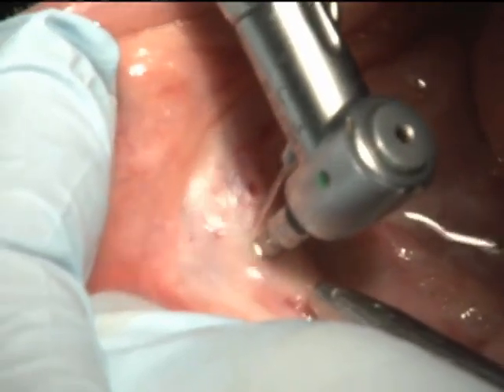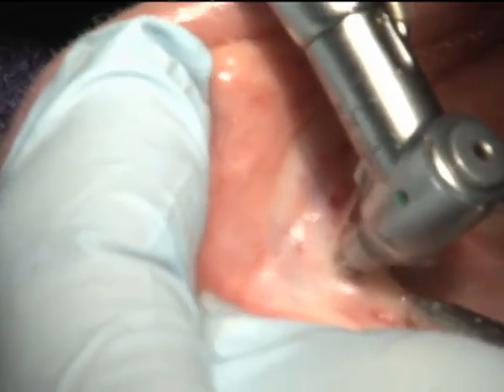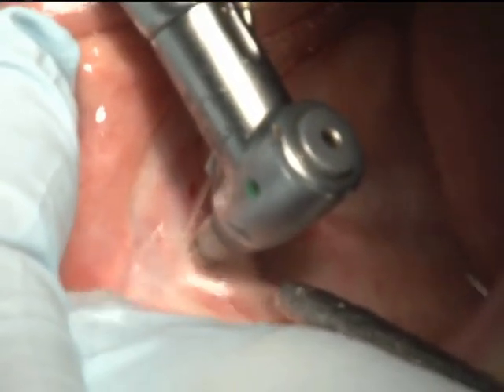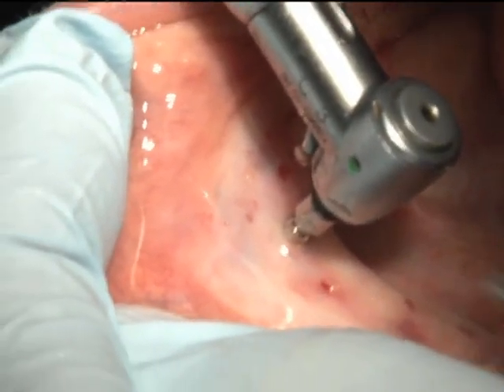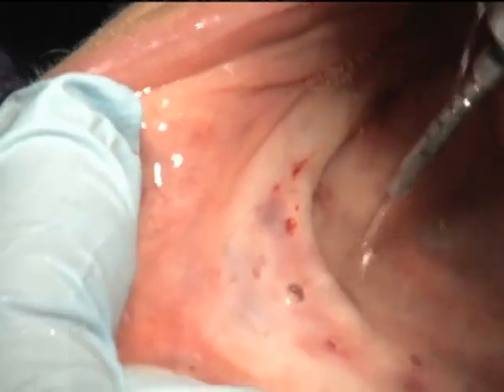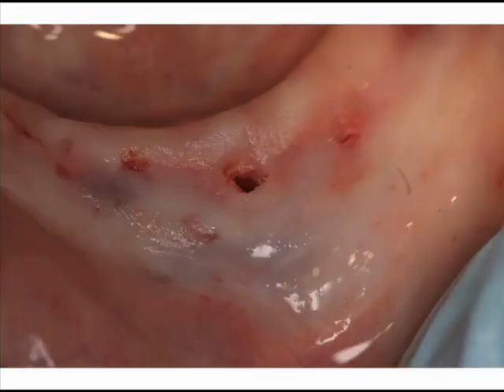Because these are self-tapping implants, there's no need to use a thread former. The bone was dense, but not that dense. The final drill used to form the osteotomy is side cutting only. The pilot drill alone determines the depth of the implant placement, and there are no intermediate sized drills used in this technique. Figure 24 demonstrates the final osteotomy site through the tissue.